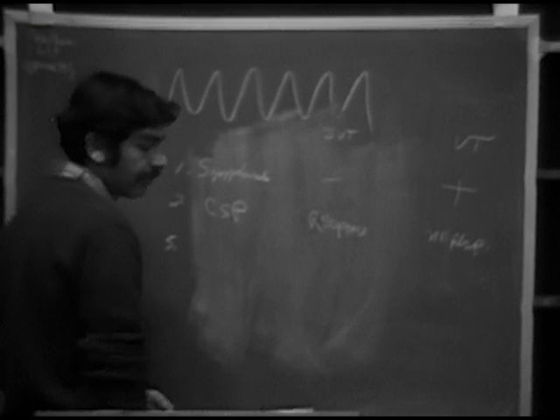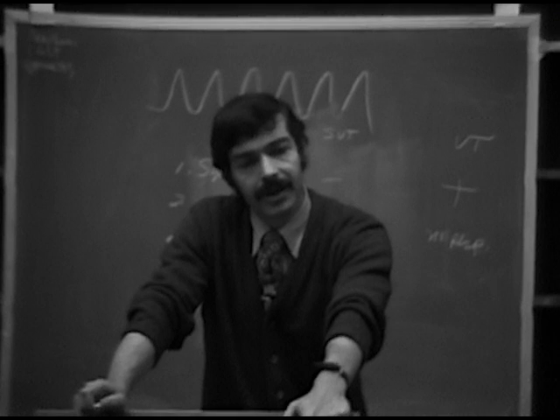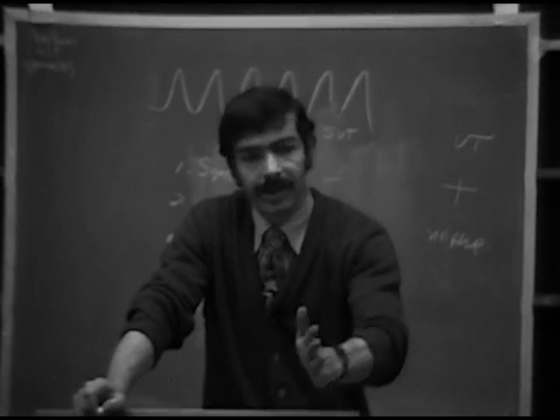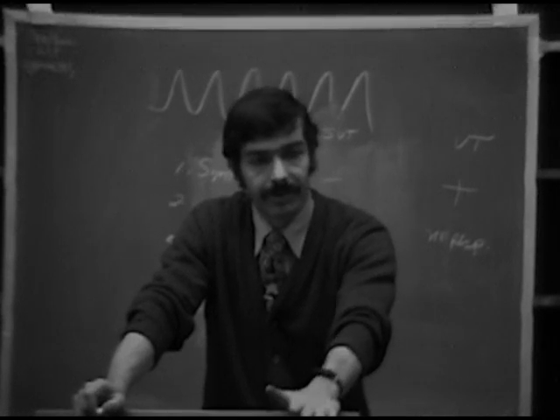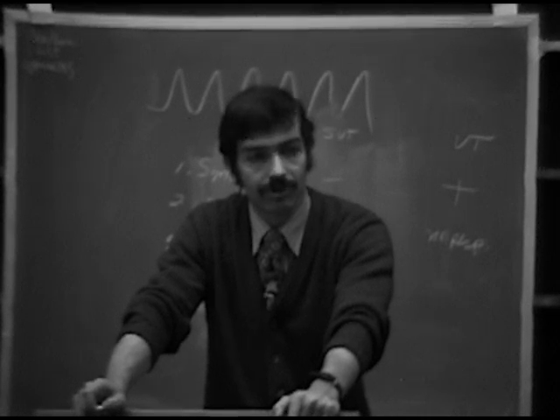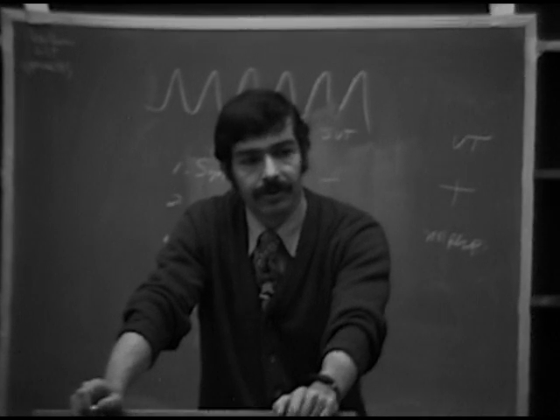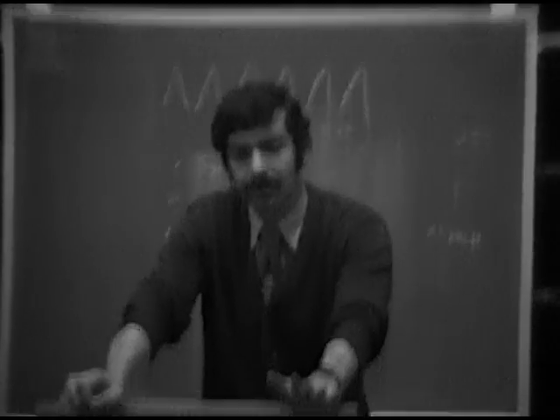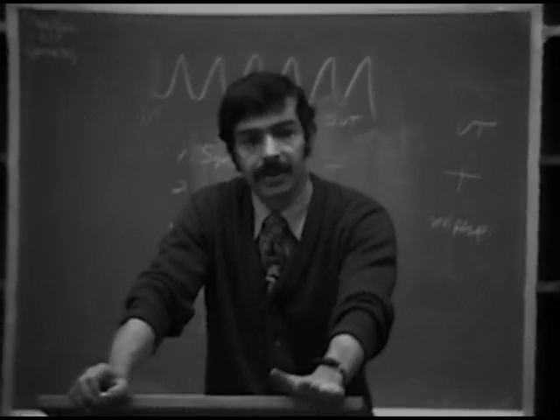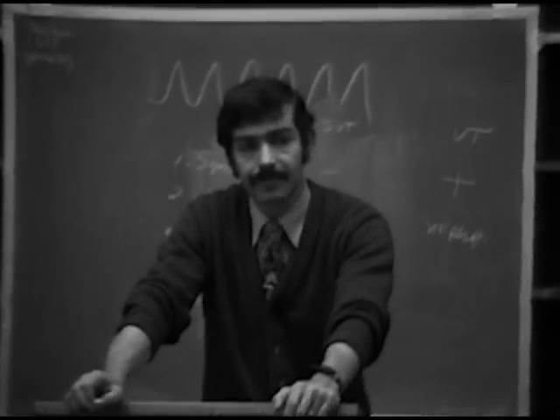Now, a third thing, what else can you do? Well, as we indicated before, when you're looking at supraventricular arrhythmias, you certainly want to look at the P-wave situation. In ventricular arrhythmias, you want to see the relationship of the P-waves to the QRS complex. So you go through the usual maneuver of looking for P-waves that we described previously. And just to review those, the first thing you do is you take a full electrocardiogram and you look at every lead, because in some lead that you might least suspect it in, you might see very nice P-waves. Right?